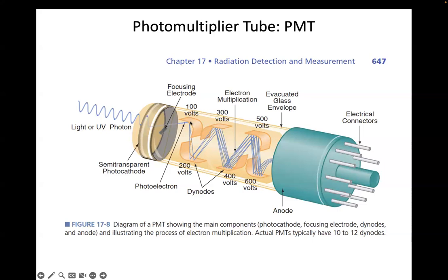And this dynode is 100 volts higher than this one. So they all fire down towards this dynode. And then each one of those electrons creates a shower itself. And so you get an exponentially growing number of electrons going through each one of these voltage drops. And so by the time you get to the end here, this shower of electrons is considerable, right? So you have a large enough amount of charge to generate a pulse out of this thing. And this is called a photomultiplier tube. And it's been around for a really long time. I used it as an undergraduate physics student to do laboratories in second year undergraduate physics. And it's still used a lot in nuclear medicine, right?